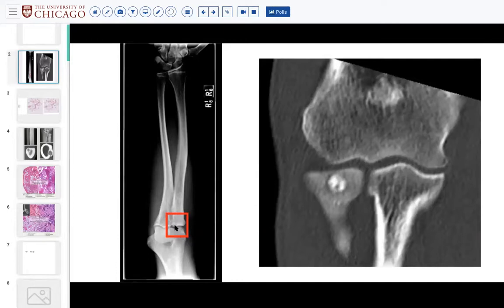Awesome. So to recapitulate, the lesion is basically right there. Yep. And I guess, is this the same patient? Yes. Okay. The one on the side is a zoom up on the CT. Oh, I see. I think I might have flipped it. No, it's fine. Because in this case, the hand is at the top, and in the image on the right, the hand would be at the bottom. So the humerus and the radius and ulna just flipped. Okay, I got it. So there's the lesion there with a little pallor and then a sclerotic area and then a pale rim.